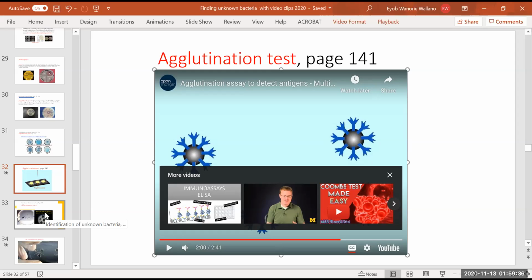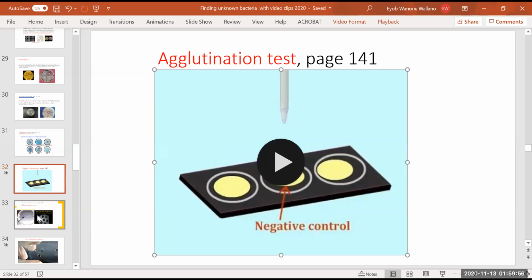You can do it. In veterinary, for example, we go on the field, we have a slide, and then the antigen, we make it on the field, without any beads. We can do it, but we are about 95% perfect on that. But if you are having the embedded type in pure research, then you need it, you see. So that is very interesting on agglutination.